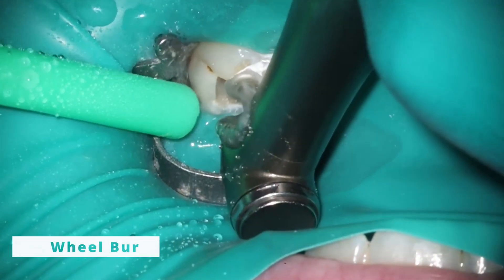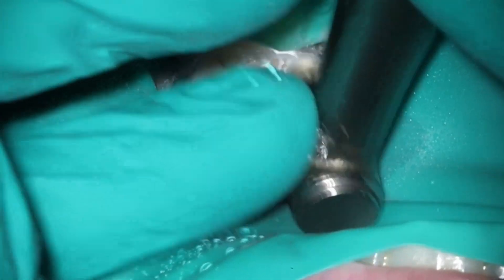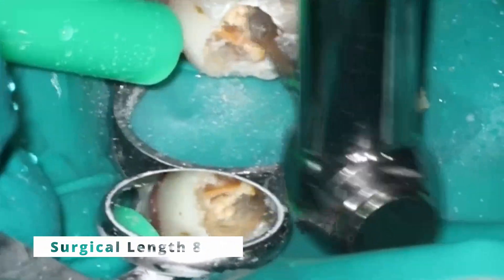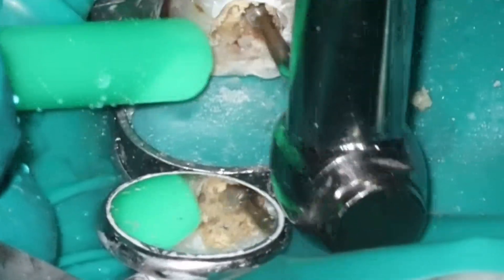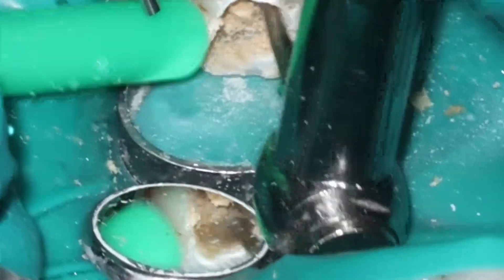First off is kind of where they are even located. The rule of symmetry that you see in lower molars and pretty much all other endo teeth as well is not going to apply here. One thing you'll notice is I needed to tighten up the screw on the bottom of this electric handpiece. I have a video showing how to repair or replace the cartridges on electric handpieces. If you do see that, all you need to do is take a little precision screwdriver set, tighten up at the bottom, and that should stop the leakage. In this case, unfortunately, one of the O-rings has gone bad, and I'm working with the company to get some replacements.